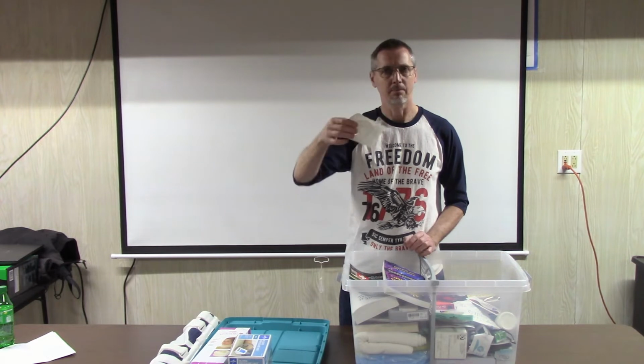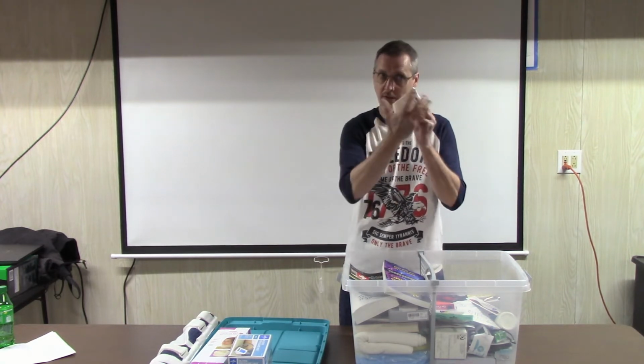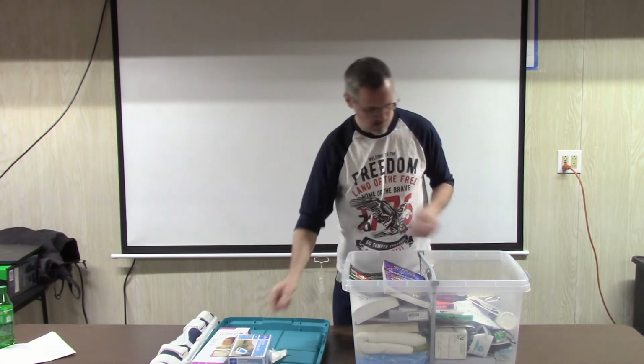It's like a hard eye patch cover. If you need to patch somebody's eye, you can stick it over there and it doesn't push into their eye.